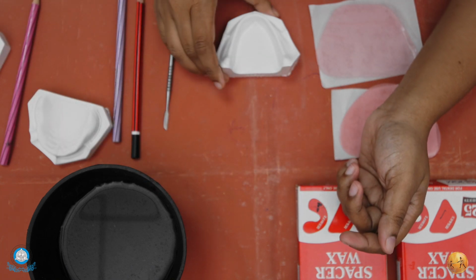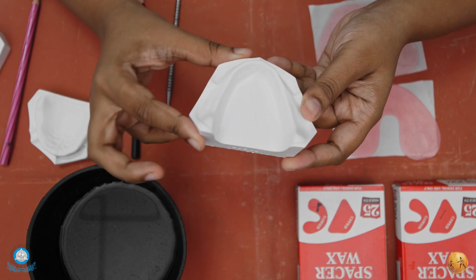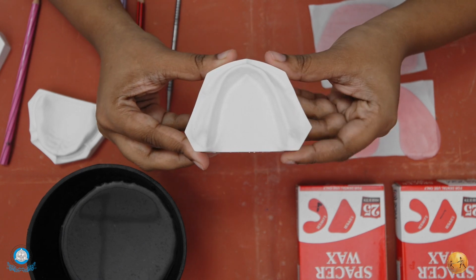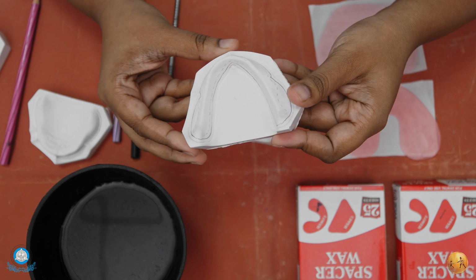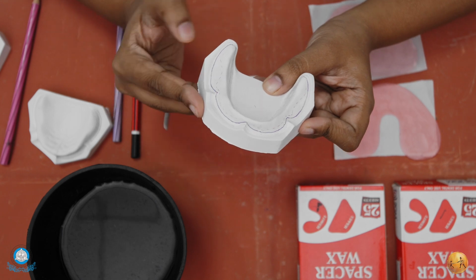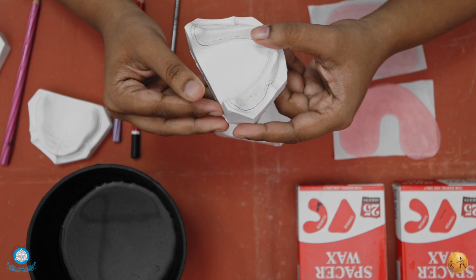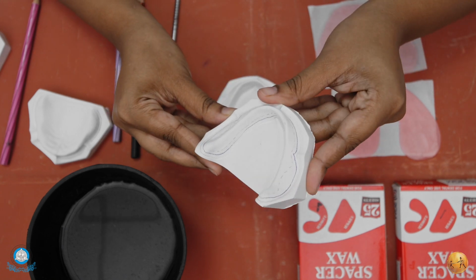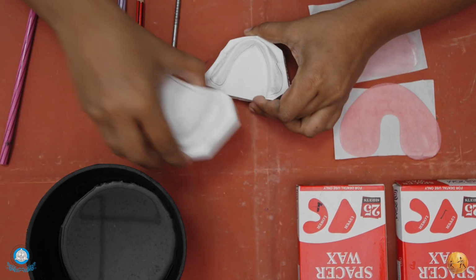Now coming to the maxillary cast, it will look like this. The mandibular cast will look like this. In the same way we are going to put 3 lines on the mandibular cast, relieving the buccal shelf area. After putting up the lines, the cast is going to look like this. Now our casts are ready to receive the spacer wax.